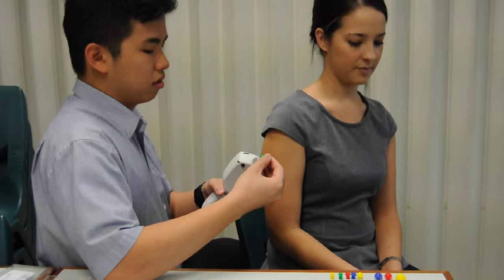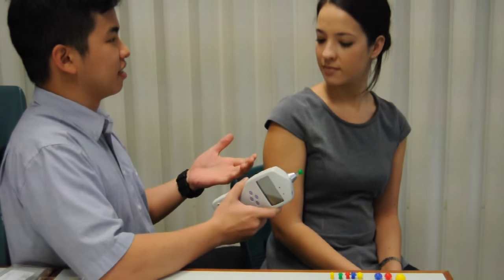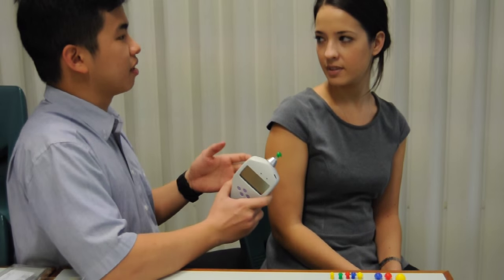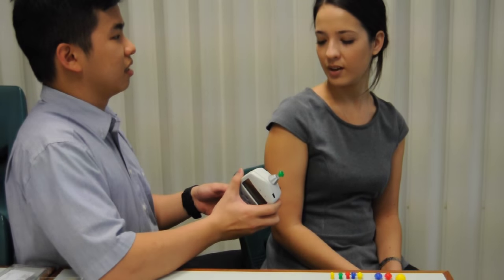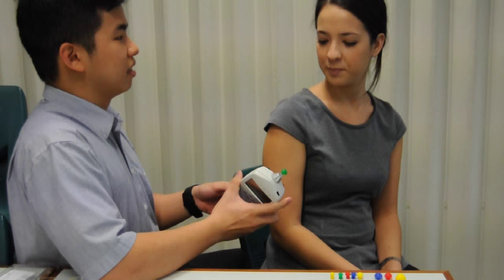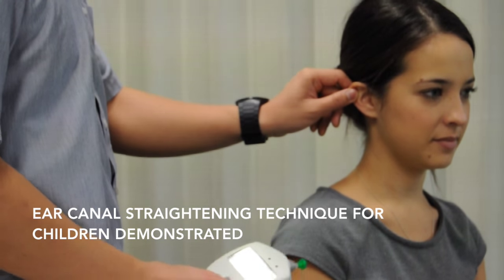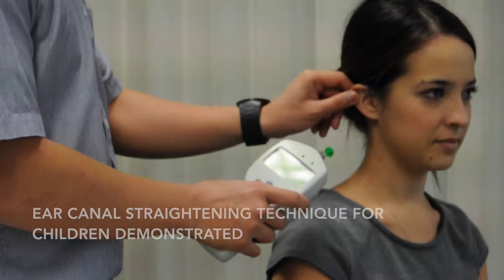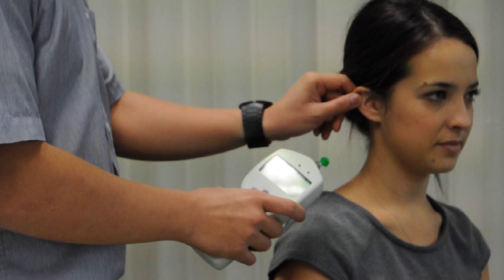Explain to the client that this is a quick test that assesses their middle ear health. Inform them that during the test they will need to remain still and not speak. They may hear some sounds and feel a change in pressure. In order to straighten the ear canal, pull the client's ear up and backwards in adults, and downwards and backwards in children.